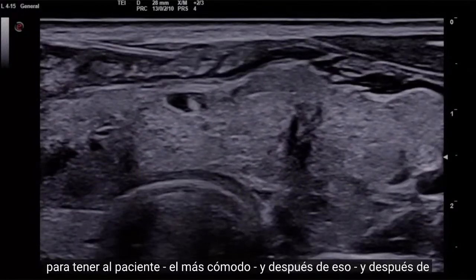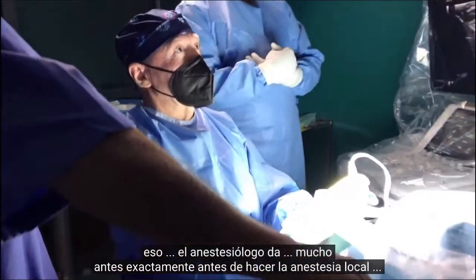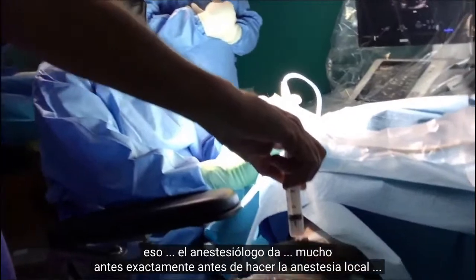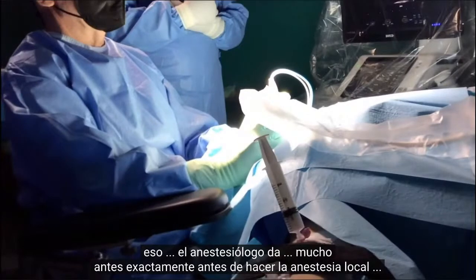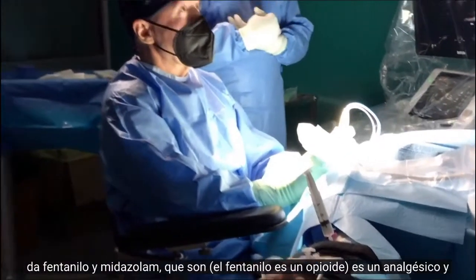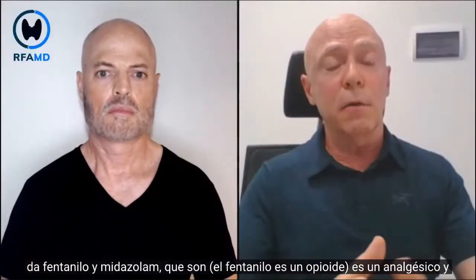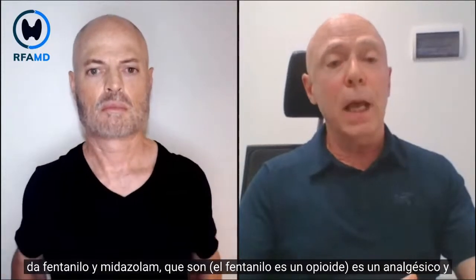So pericapsular anesthesia is very important in order to have the patient the most comfortable. Exactly before local anesthesia, the anesthesiologist gives some fentanyl, an opioid painkiller, and midazolam, a benzodiazepine sedation drug.